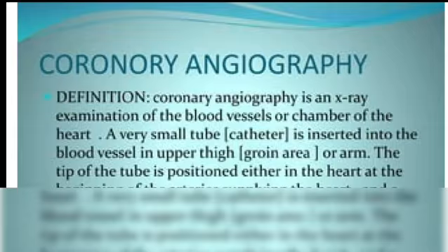The common method for introducing catheters is the Seldinger technique, developed by Dr. Seldinger. The common vessels used for catheterization are the femoral artery, brachial artery, axillary artery, and radial artery.